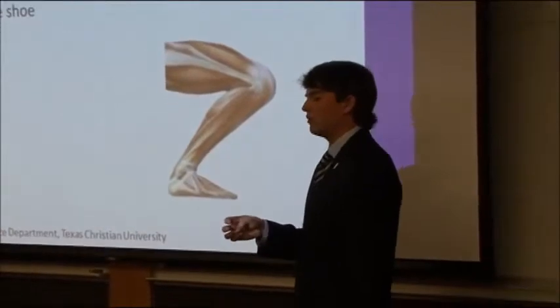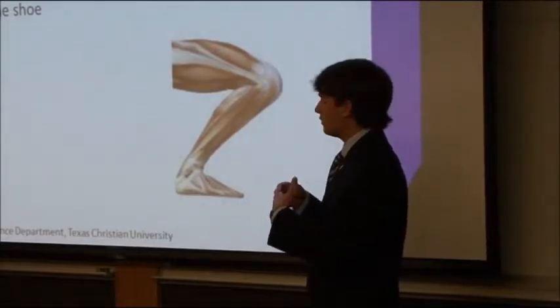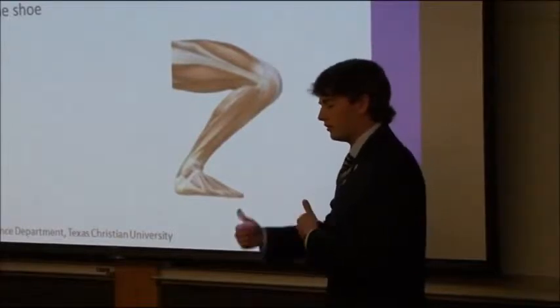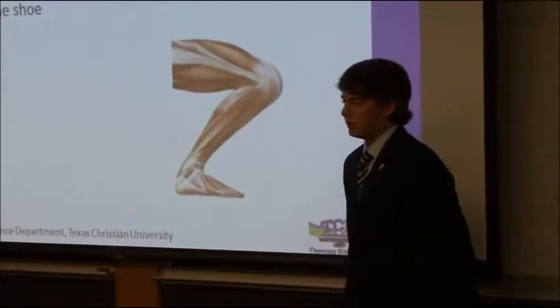In order to allow for the difference between the Kinect and what therapists see, we need to add a little bit of tolerance to the Z value of the foot, because the Kinect is tracking using the ball of the foot rather than the end of the shoe. With this tolerance, we're able to offset that joint so that it is the same as what a therapist would see when they're grading it.